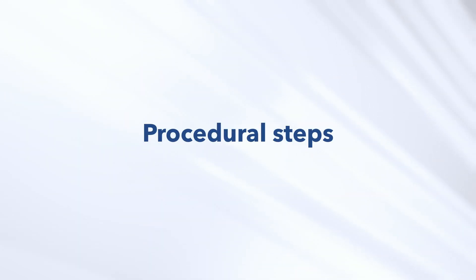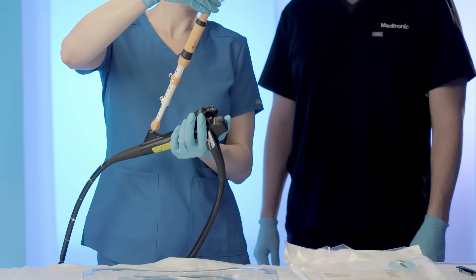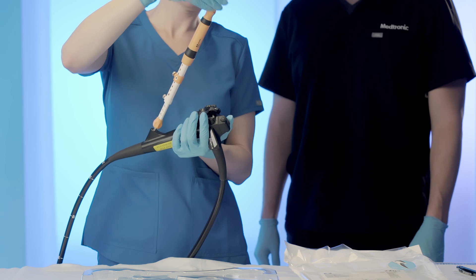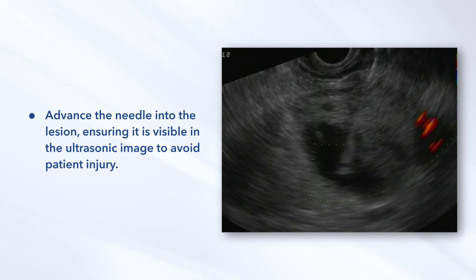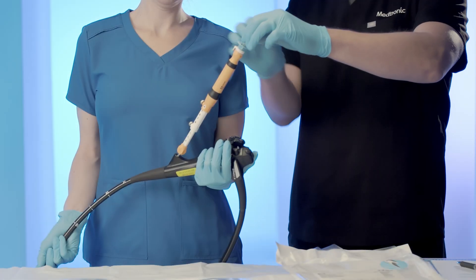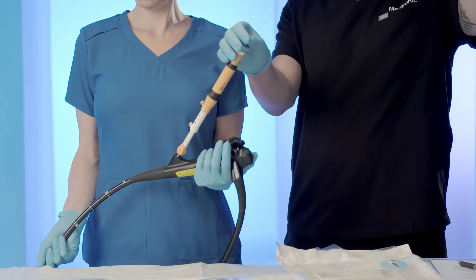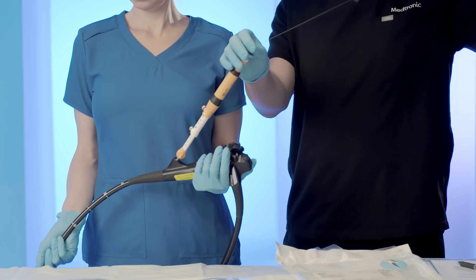Procedural Steps — Extend the needle: While maintaining the position of the ultrasound endoscope, extend the needle by advancing the needle handle to the repositioned safety ring. Advance the needle into the lesion, ensuring it is visible in the ultrasonic image to avoid patient injury. Remove the stylet: Remove the stylet from the needle by unlocking the stylet hub from the needle luer and retracting it from the needle.